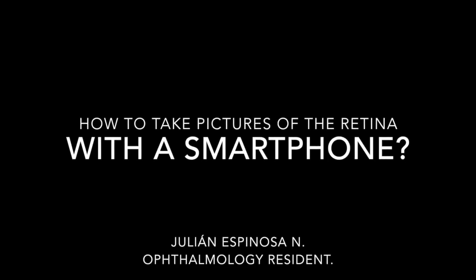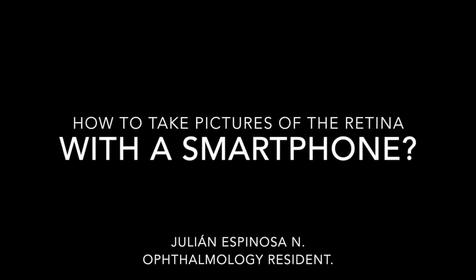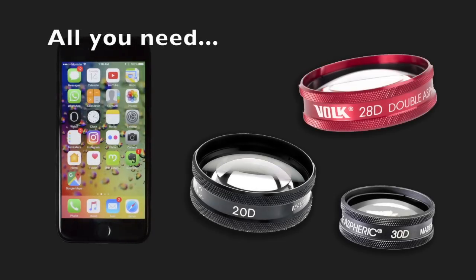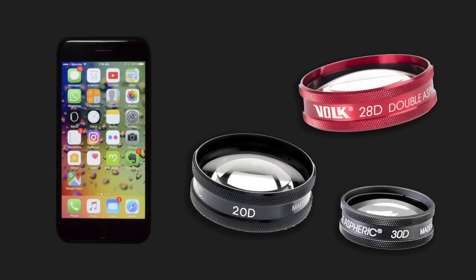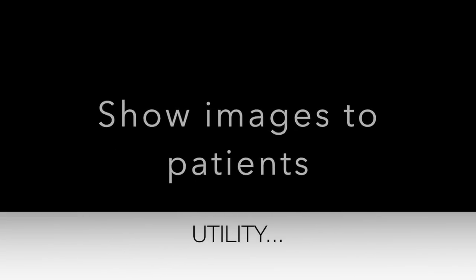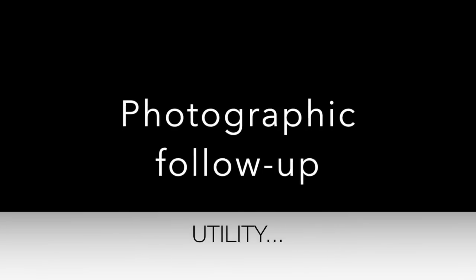This is a video tutorial on how to take pictures of the retina with a smartphone. All you need is a smartphone with a camera and a 20, 28 or 30 dioptric lens for indirect ophthalmoscopy. It is very useful to have these images for telemedicine, to show the images to the patient, photographic follow-up of lesions, academic purposes among others.